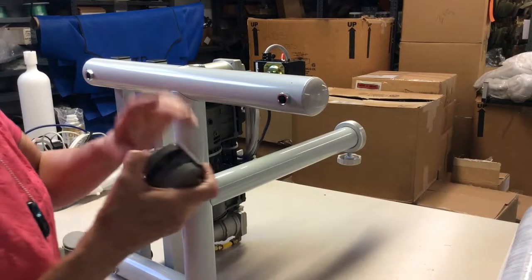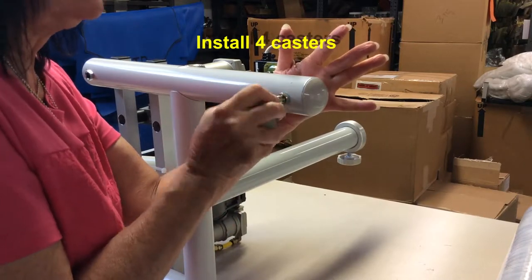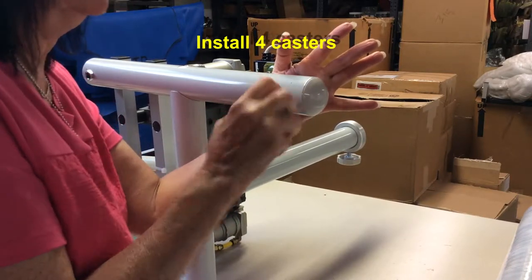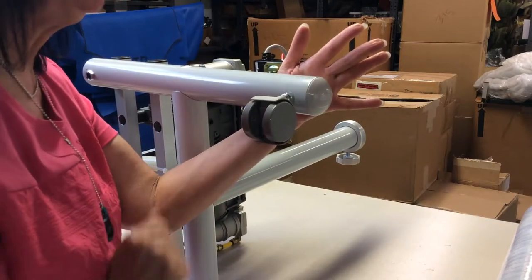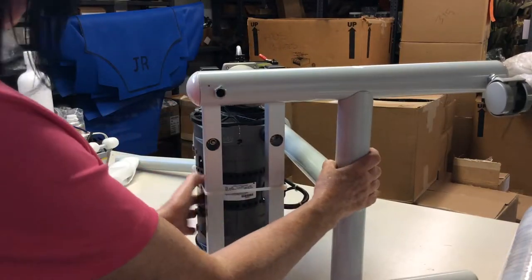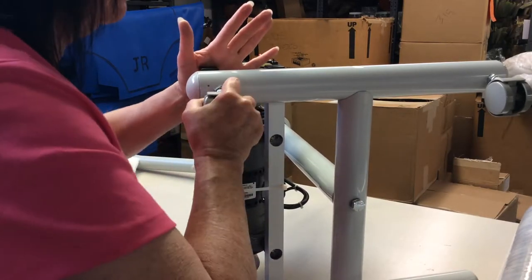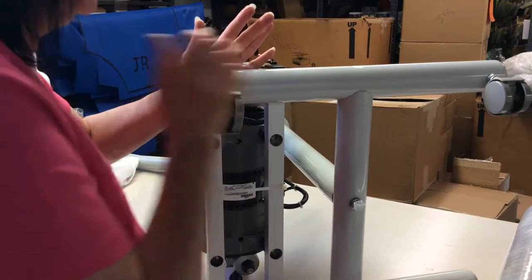Next, put on the casters. Hold the H-frame on this side, rock the caster back and forth, and then push it all the way in. Hold it, rock it, and push.